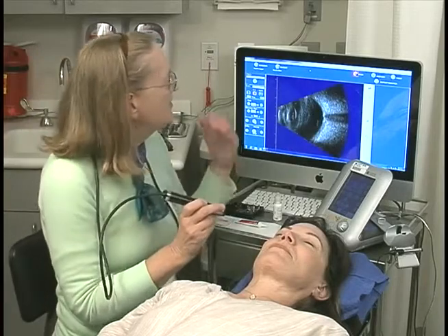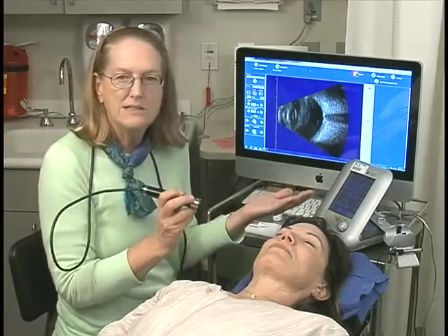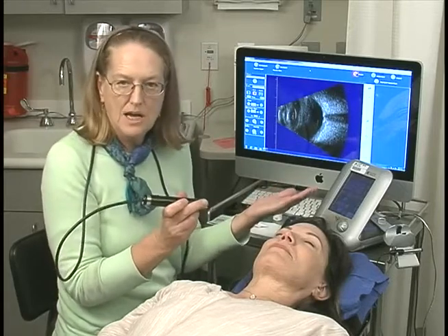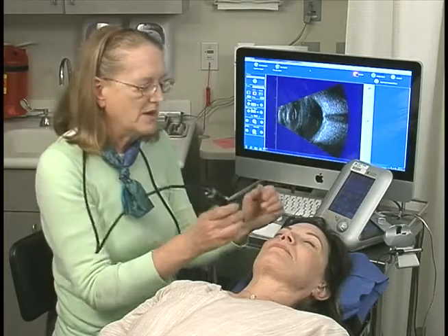Now the vertical axial scan some people like to do, but I find it less clinically useful. I wouldn't take the time to do that unless you had a pathology that was there.